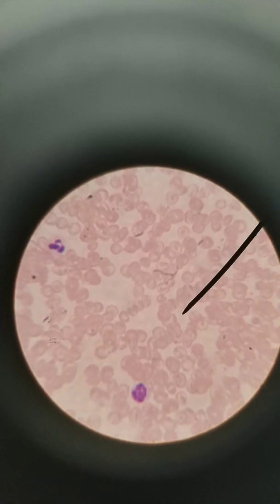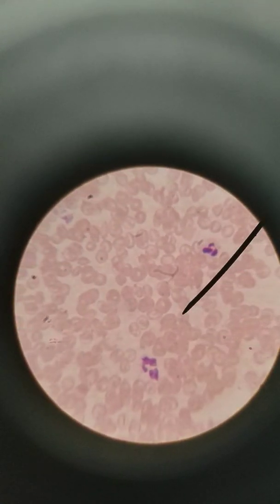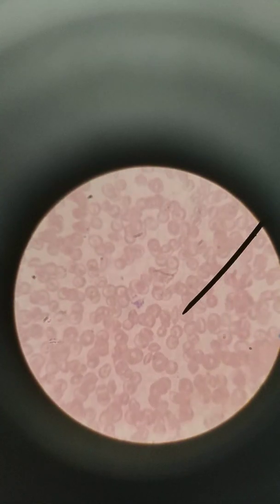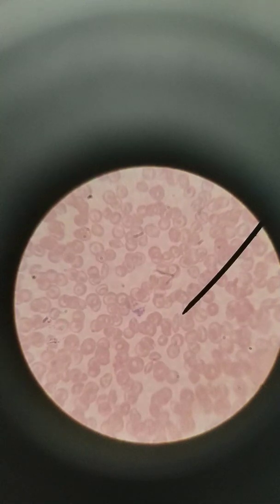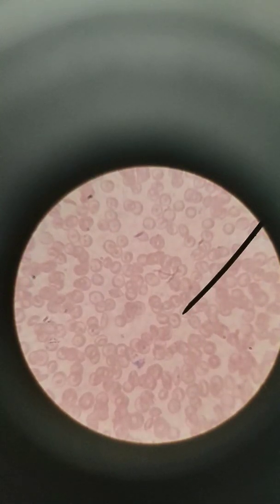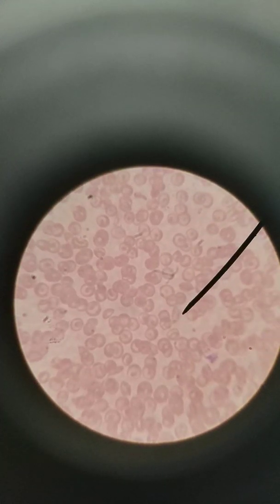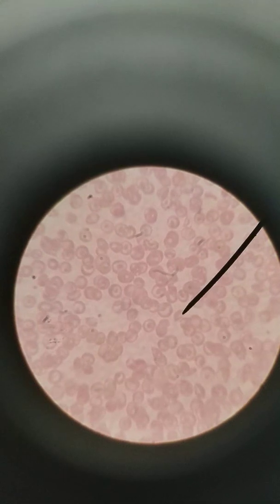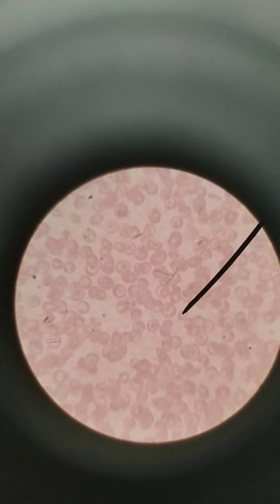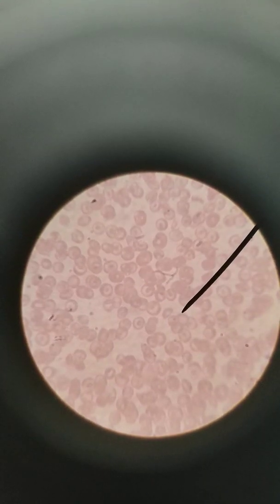Another good example. I'm trying to find the classic example of this condition. See if you've guessed it by now. Over here, very, very long and pointy. This one right here. And here's another good one. Kind of looks like a half crescent right here. I'm going to move it to the right. Yeah, kind of looks like a crescent.